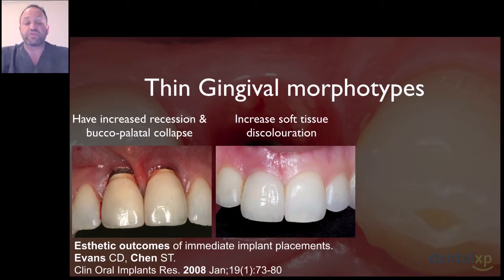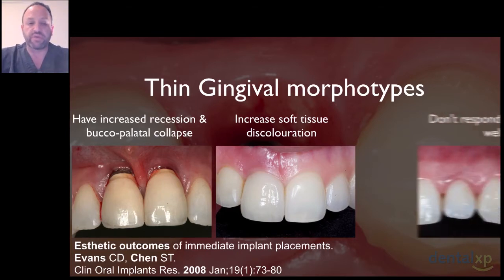Another thing you can see with this case is that it's the kind of case that we show and say, ooh la la, what a fantastic case. Give this case a couple of years and you might find that it's not looking as good as it is now, even though it's still not a perfect case with regards to the coloring.